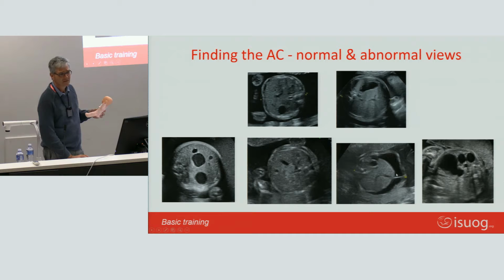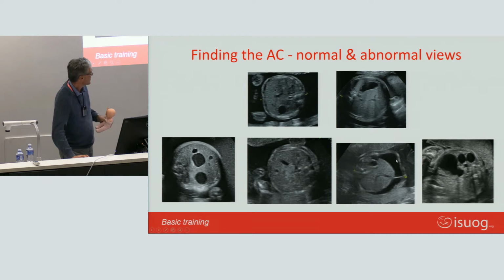So what's happening here? So lots of fluid, so ascitic fluid, and this, which of these babies must be, okay, let's go to the last one. And this, lots of fluid, lots of fluid, pockets. So you can't really say for sure. It might be a lower intestinal obstruction, but where that's sitting, that looks pretty much like kidney to me. And so maybe that's a nasty kidney obstruction.